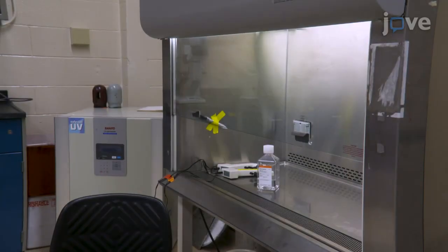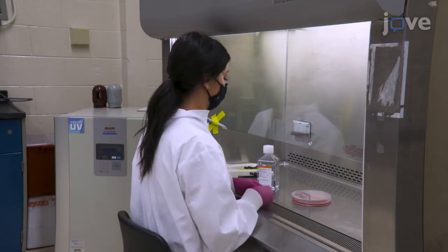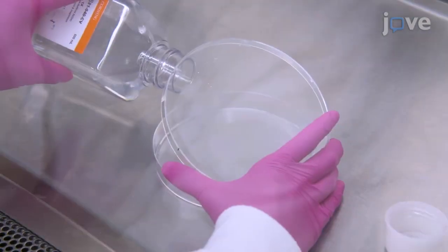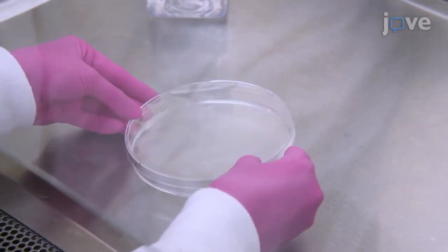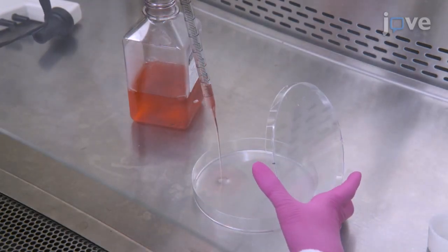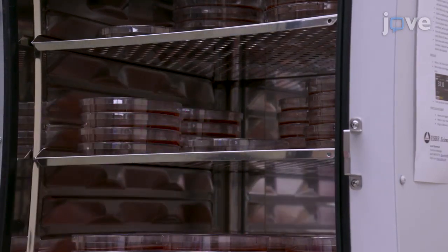To begin, collect HEK293 cells from the culture when it reaches 80% confluency. Aspirate the media before gently washing the cell culture plate with 3 milliliters of PBS. Then, aspirate PBS and add 3 milliliters of trypsin. Incubate the plates for 2 minutes at 37 degrees Celsius.